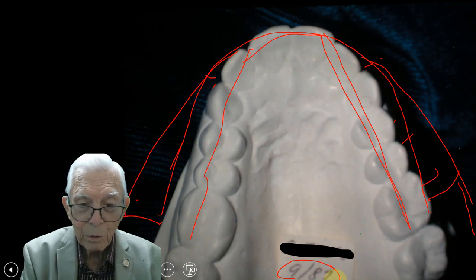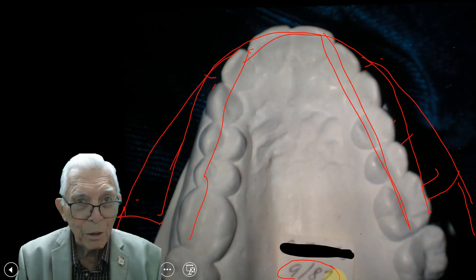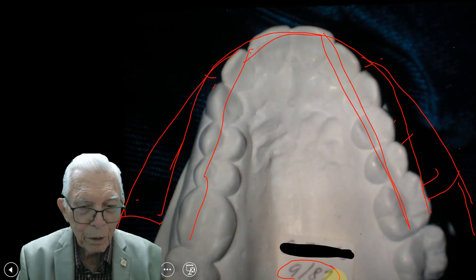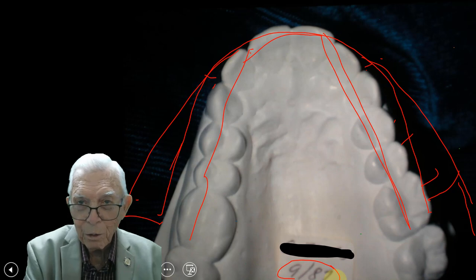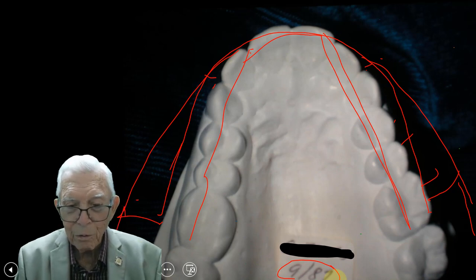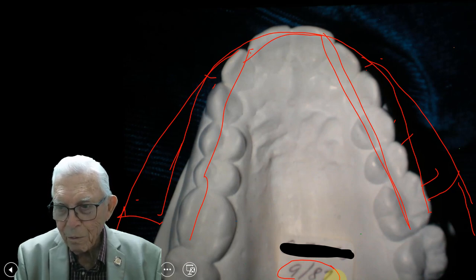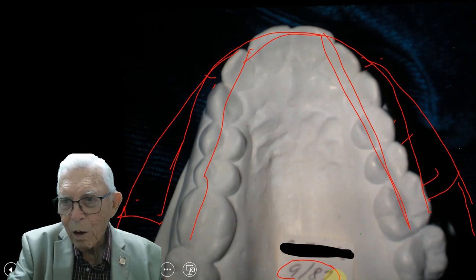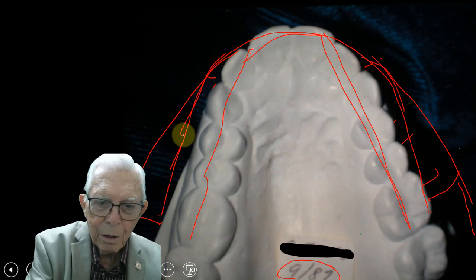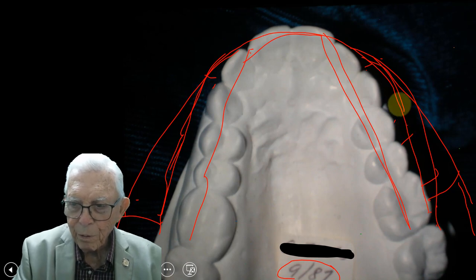If you've got an ankylosed tooth and you bring the whole arch out, the ankylosed tooth tends to go out with the bone structure — it's on the bus, you move the bus out, it goes with the bus. So we're going to take this arrowhead arch and widen it in the posterior area, then bring it back in anteriorly. You need to bend your Big Daddy Arch Wire in that shape and put it up there.